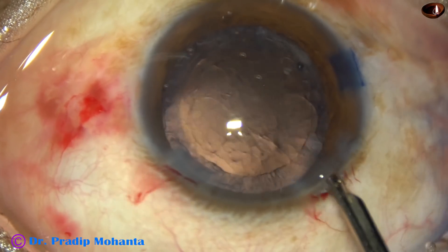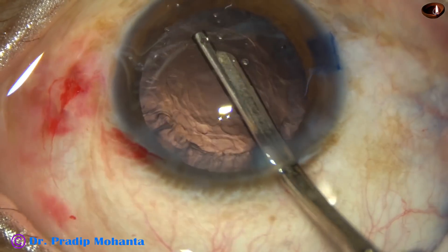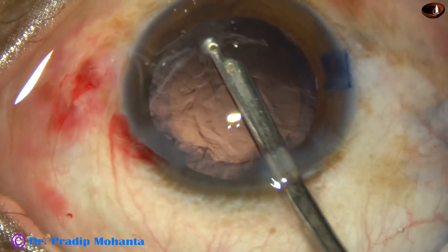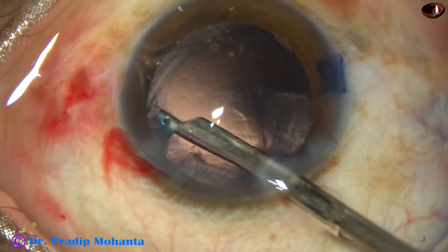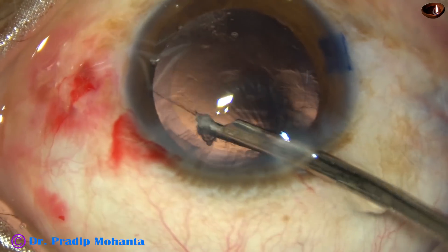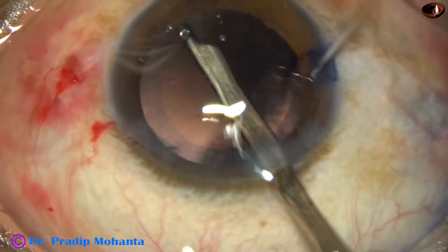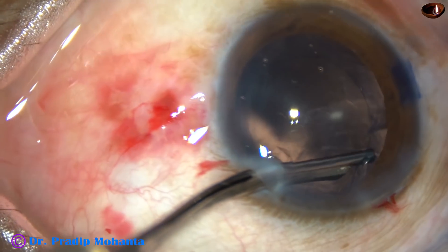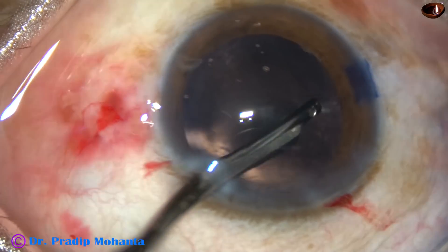And now you have to clean the cortical lens matter. I use a 23G Simcoe in many of my cases. I also use bi-manual irrigation aspiration. Usually I don't use coaxial irrigation aspiration — what you will use is your choice. Make a thorough job; clean the cortex very nicely all around and polish the posterior capsule. I have my own way of polishing the posterior capsule.